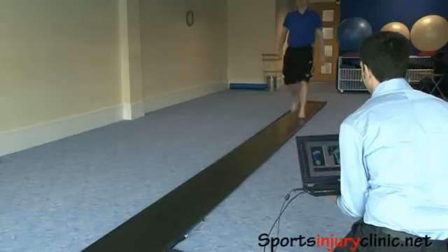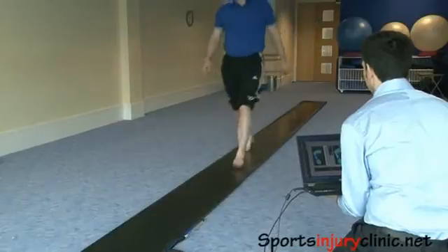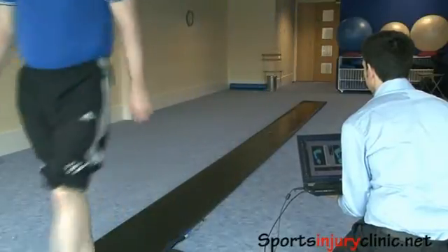The foot scanner that we use in the clinic is a very useful piece of equipment. It maps exactly the way your foot moves as you move over the ground. So in real time, up to 500 pictures a second, we can see exactly how your foot's moving.